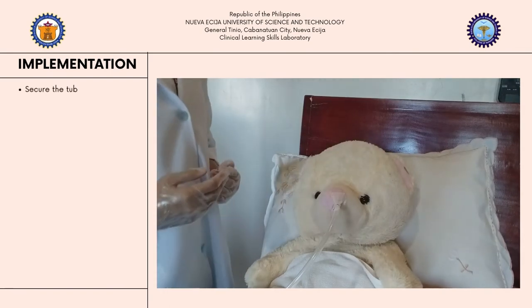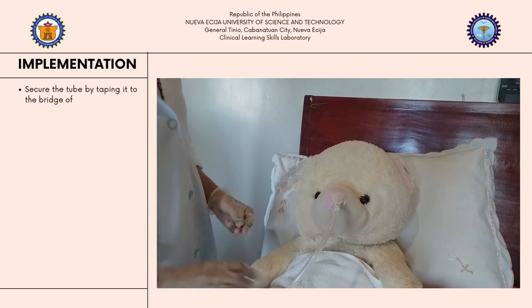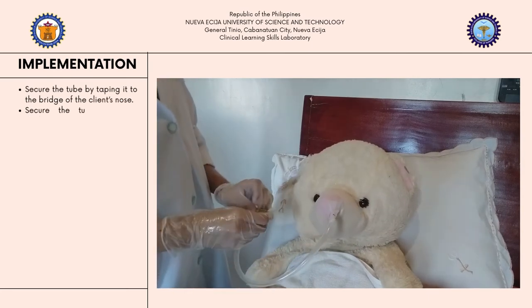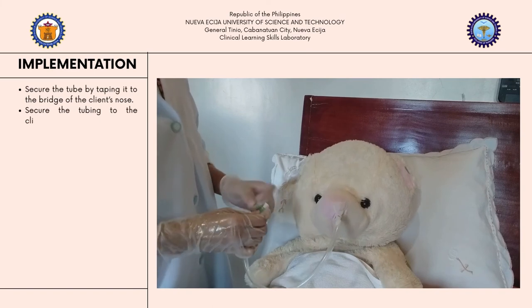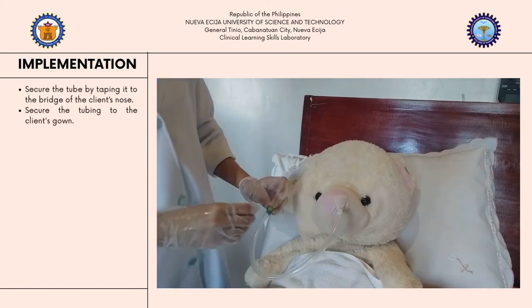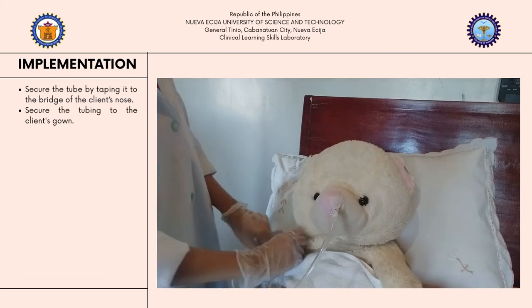Lastly, we need to secure the tubing to the client's gown using an elastic band, and loop this at the end of the tubing, and secure it to the gown using a safety pin.